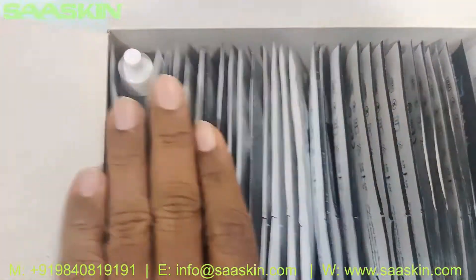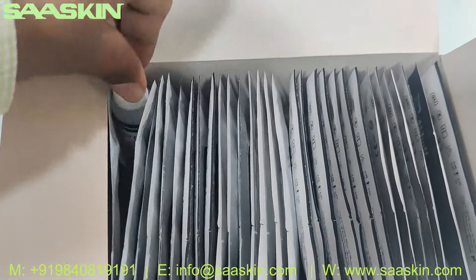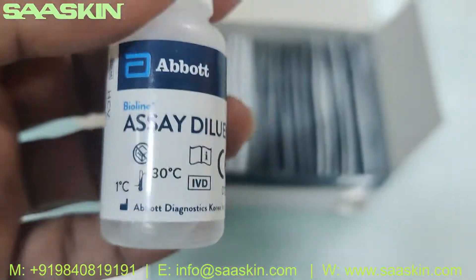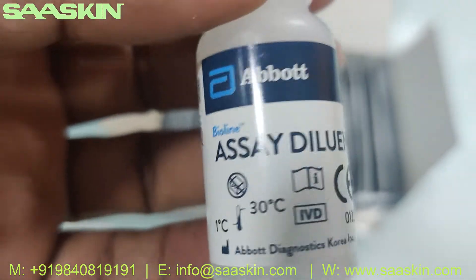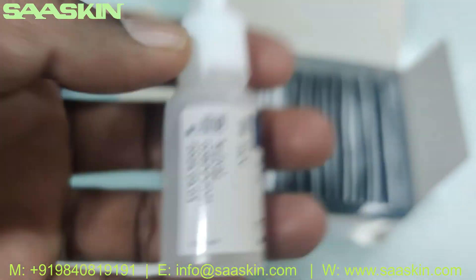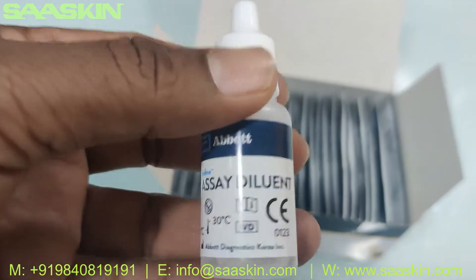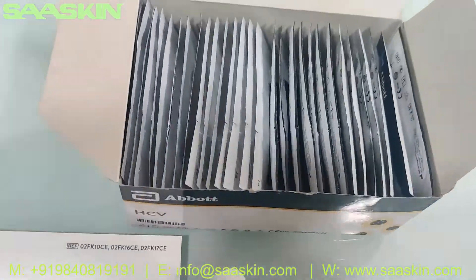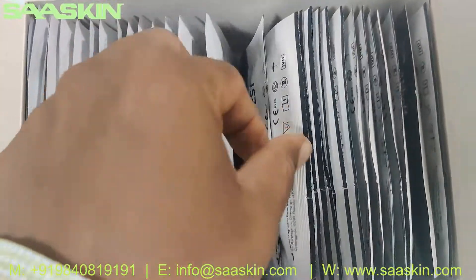This is a 30 test kit pack box. Inside you can see there is a buffer bottle — here it is, it's a 5ml buffer bottle for conducting the test. And inside you can see the 30 test cassettes here — let me put two cassettes for you.